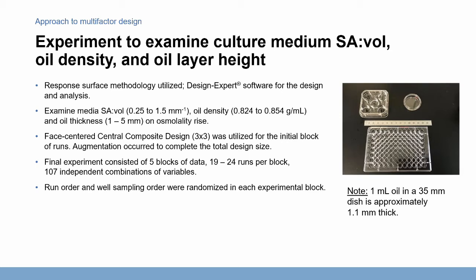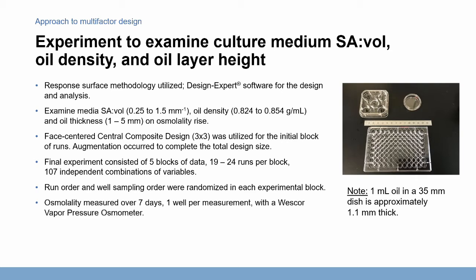And the software does a great job of randomly ordering the factor level combinations within the block. And also, when I was using this 96 well plate here, each column of wells would have included one treatment. And so not only did I randomize the location within this plate, I also randomized the order in which I sampled these 8 wells. And for each of the wells, I would take a sample, measure the osmolality with my osmometer, and record the time it was measured and the osmolality itself.